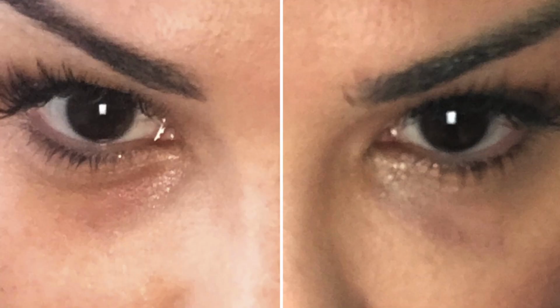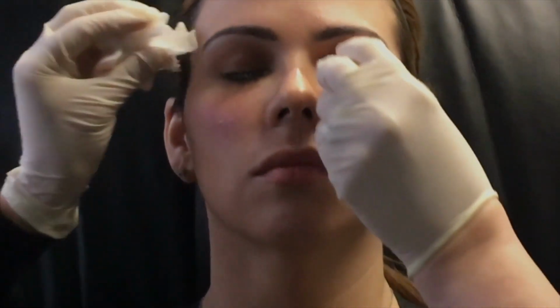I think this procedure using injection of a filler to achieve fullness in the tear trough that's been lost is probably a really instant hit with most people in terms of seeing dramatic improvement. You can see from one side to the other how that looks. So now we're going to go back and on her left we're going to do the same thing. But it's a really dramatic difference for what would be considered a small amount of financial output to achieve that look.